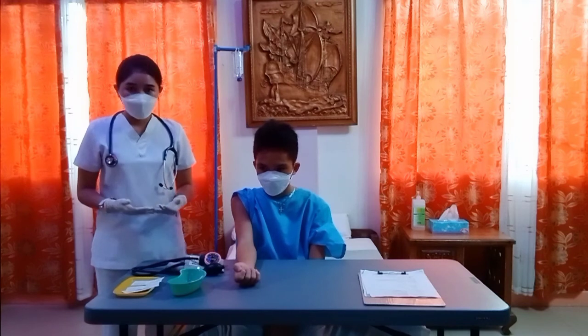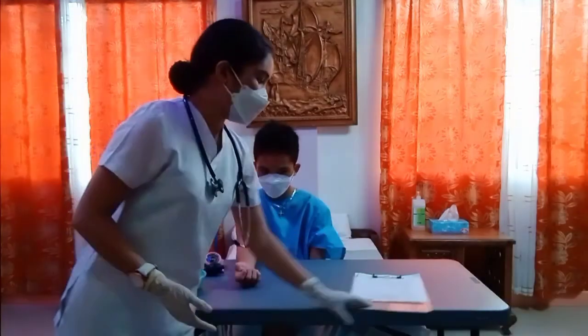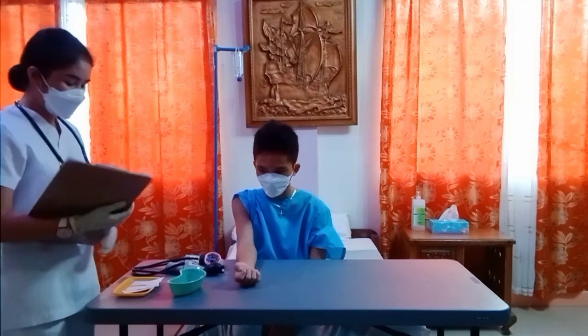It is the client's right to be informed with the findings. This will promote cooperation and will foster trust during the implementation of a nursing intervention. Lastly, record the findings into the patient chart.